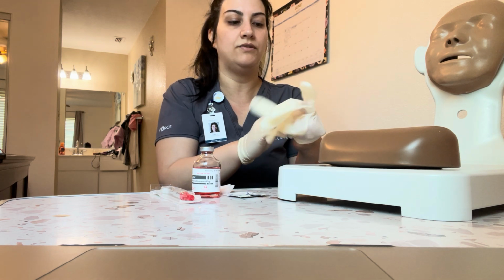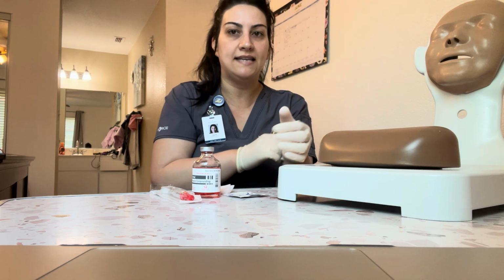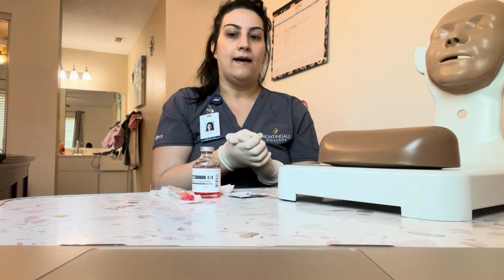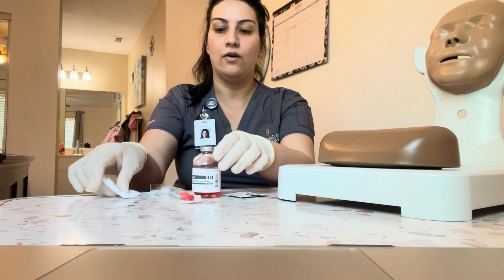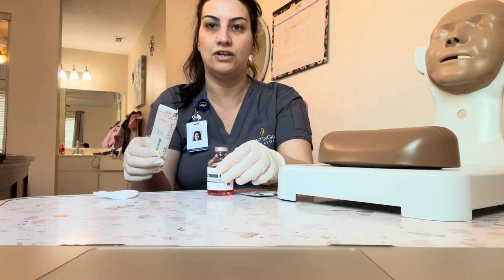So Ms. Smith, just want to let you know that upon injection, you might feel a little bit of stinging and burning. That is normal. So after I let the patient know that, I'm going to start with my syringe and my medication here.